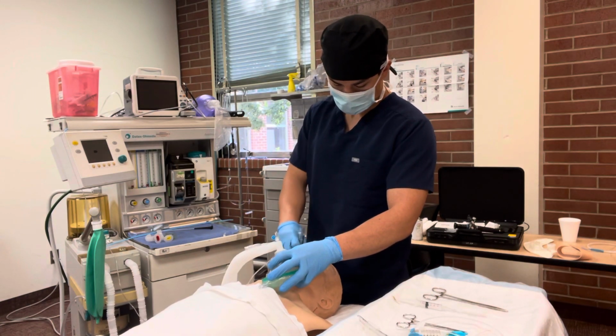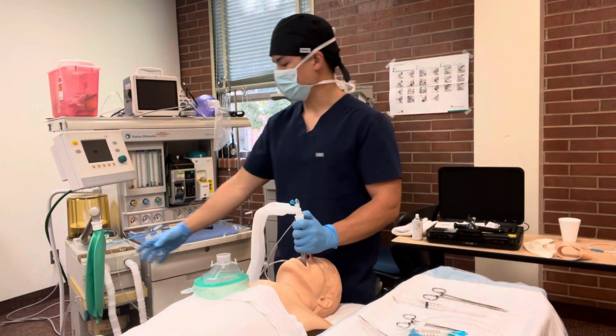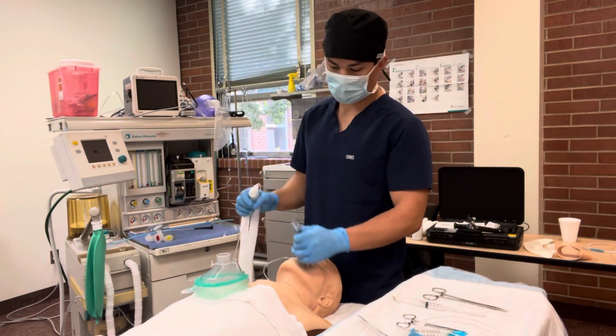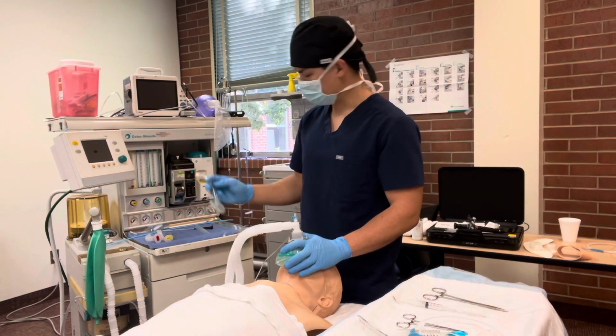I'll throw in an LMA, try to ventilate. If that doesn't work, then I'm going to be thinking about waking up the patient or moving to an emergency, possibly surgical airway.